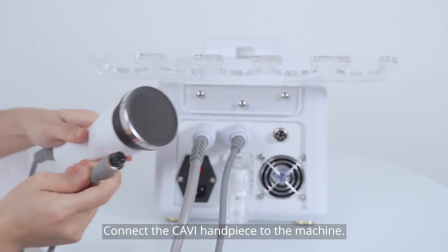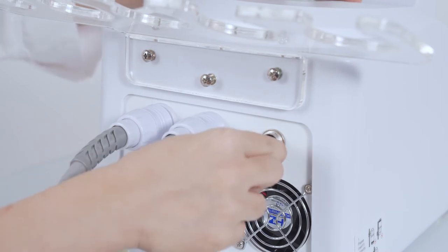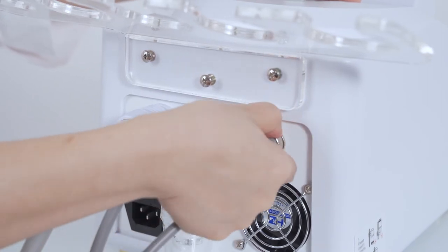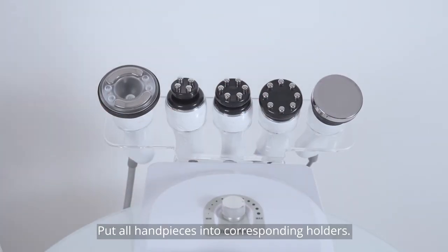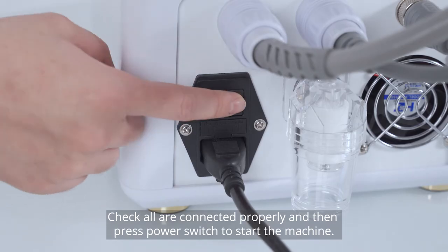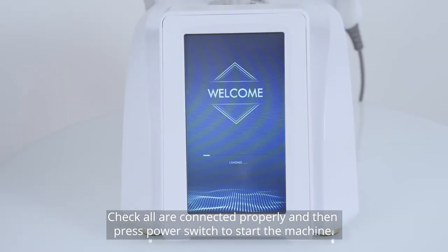Connect the cavi handpiece to the machine. Put all handpieces into their corresponding holders. Connect the power cord to the socket of the machine, check all connections are properly made, and then press the power switch to start the machine.